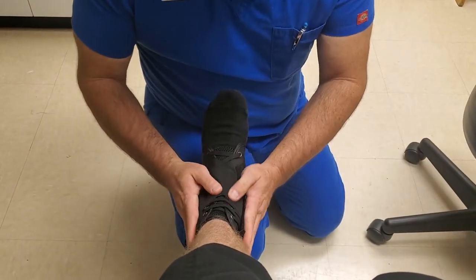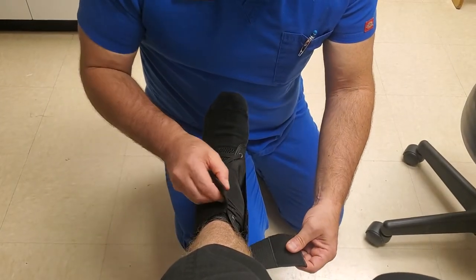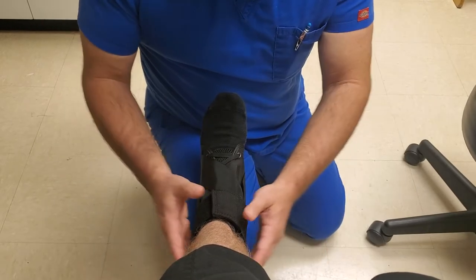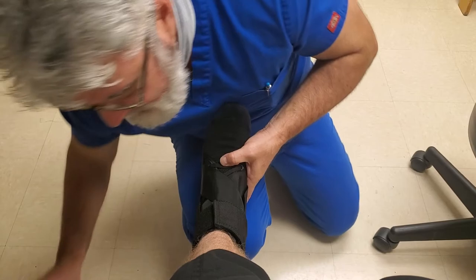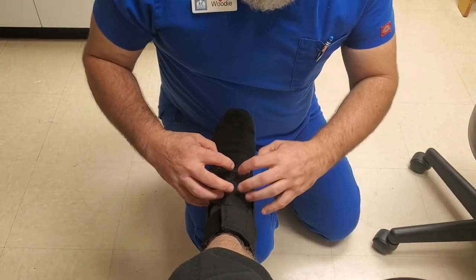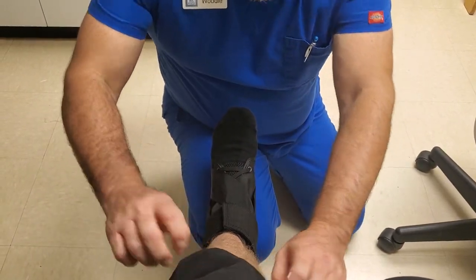You can see how it's starting to take its shape — a nice supported ankle. The top belt just secures everything in place so it doesn't come undone when the patient's being active. Then you can get their shoe or tennis shoe and have them place it right over the brace. If they have laces, they can unfasten them, slide it on, and then fasten like so.